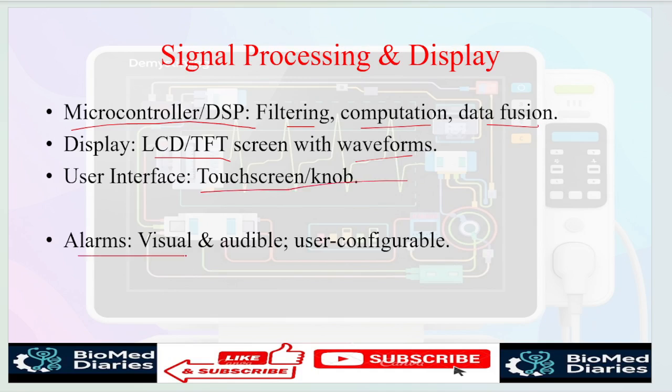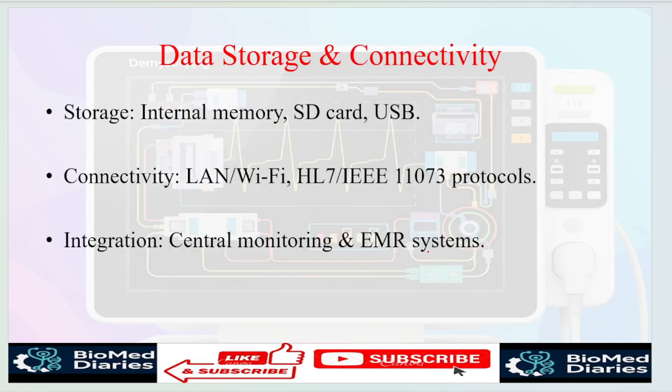In the same way, the alarm system is also available, visual and audible and user configurable. Then data storage is also one of the most used features in the patient monitor, for connectivity and data storage: internal memory, SD card or USB. Nowadays we are only using USB.